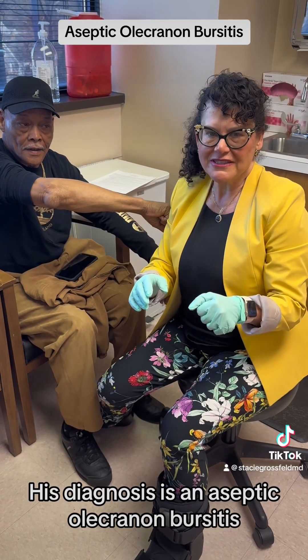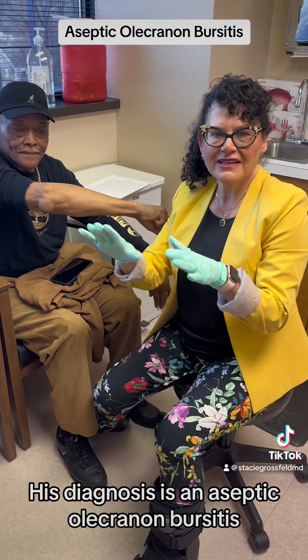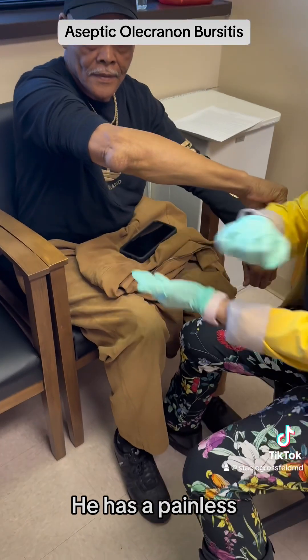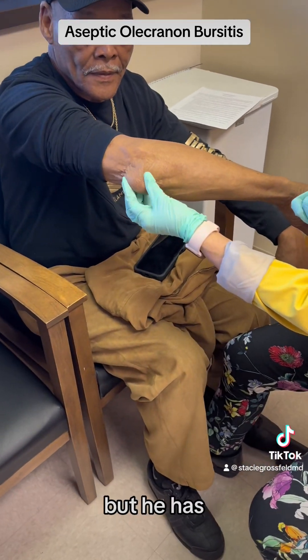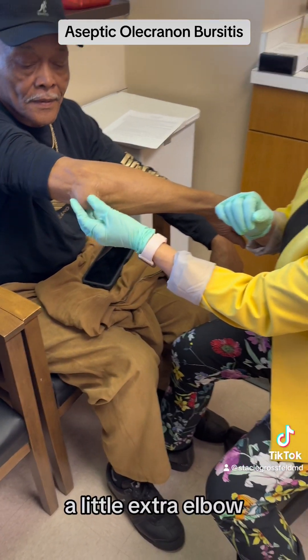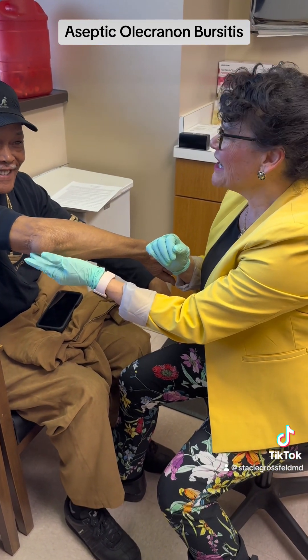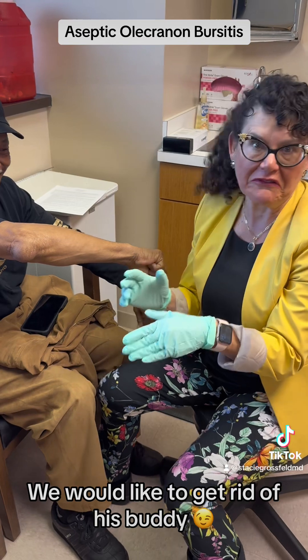His diagnosis is a non-septic olecranon bursitis. There's no erythema, there's no warmth. He's got a painless range of motion, but he has a little extra elbow — as I like to say — hanging on there. We like to get rid of that buddy.